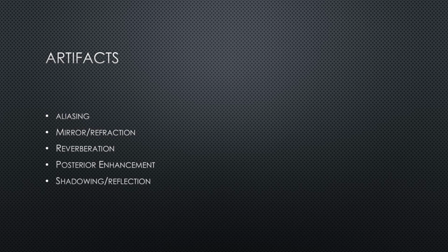And you also have shadowing. So that's a signal void that's caused by structures that strongly absorb or reflect ultrasound waves due to a sudden change in ultrasound velocity propagation. And there's two types of shadowing to be aware of. There's clean shadowing. This is what's normally traditionally thought of as shadowing, and that's where you have like either a bone or a gallstone or a kidney stone or something else, where you have this hyperechoic line of the reflection followed immediately by a dense anechoic signal void. The other type is the dirty, and that's the sonographic signature of air. So that's basically a hyperechoic reflection line that progressively becomes less echogenic over time, or rather as you go deeper into the tissue.